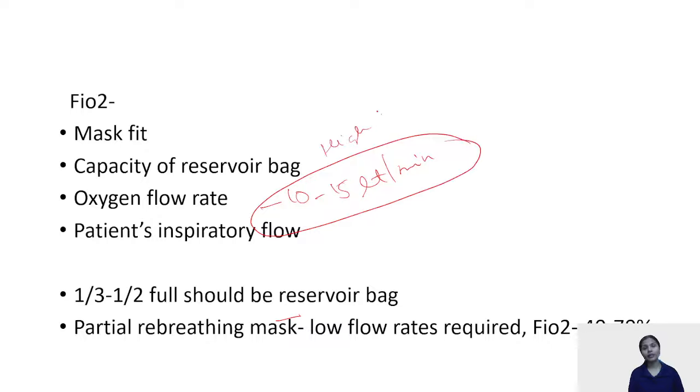High capacity reservoir bag. The patient's inspiratory flow, yes, it is dependent upon the patient's inspiratory flow, because if the patient's inspiratory flow is more, then maybe some amount of air can be entrained inside. Okay, according to patient's inspiratory flow, it is patient dependent.